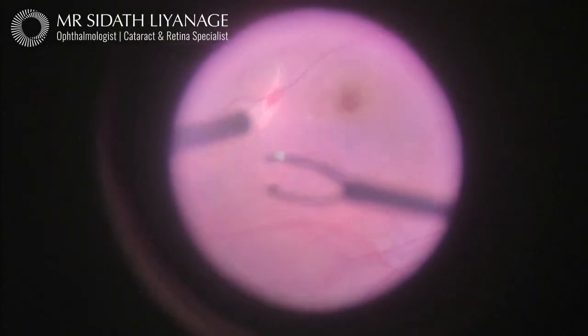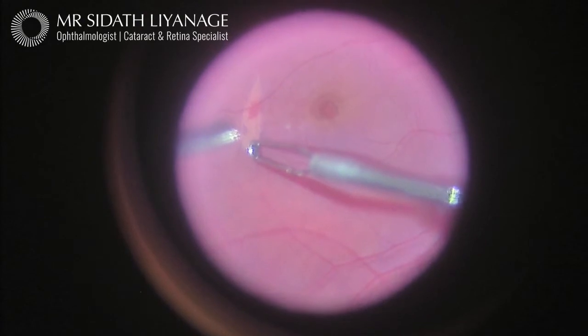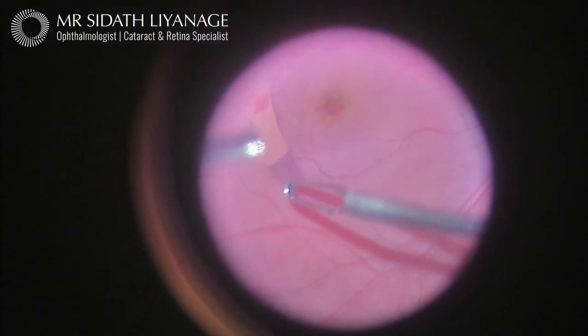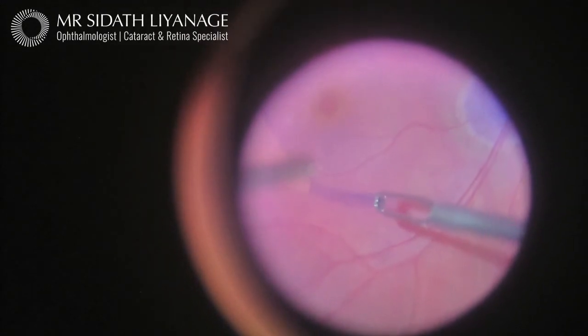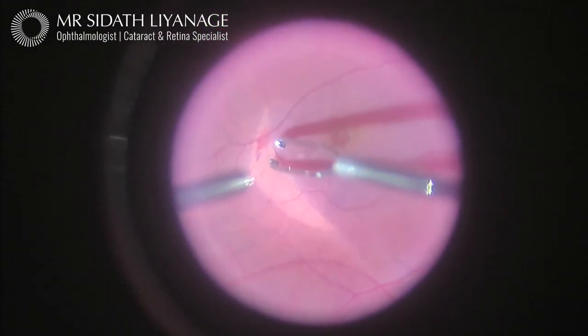I am peeling the internal limiting membrane around the hole with the fine forceps. The internal limiting membrane is the very surface of the retina, and peeling this increases the chance of the operation being successful to over 90%. I have dyed this membrane blue to help visualize it.